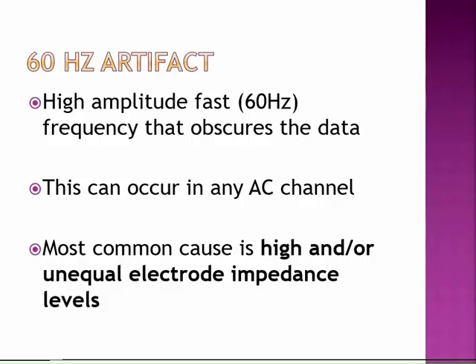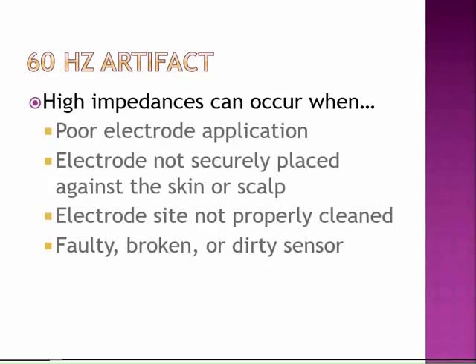So should I say it one more time, or do you understand that it's important? I'm going to say it one more time. High and unequal electrode impedances are the most common cause of 60 hertz artifact.